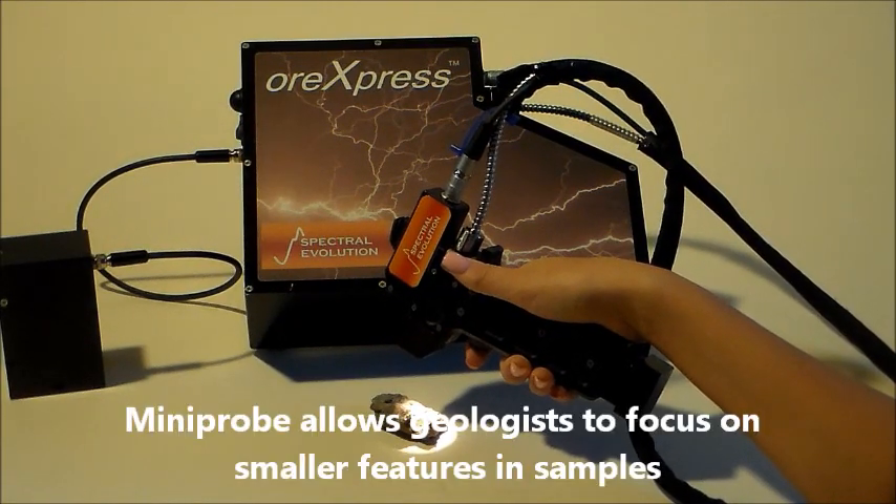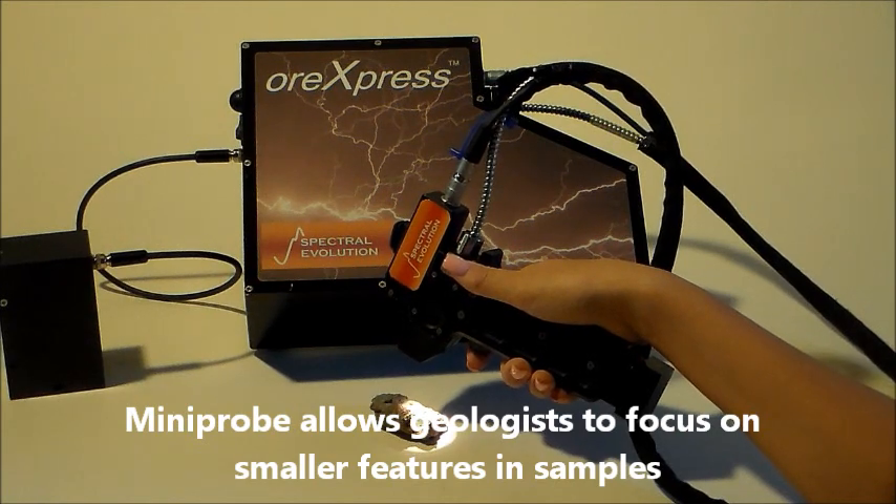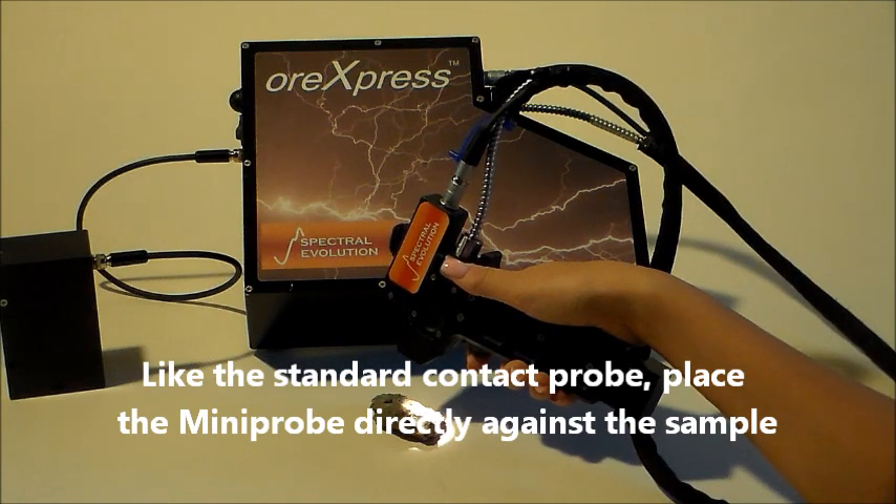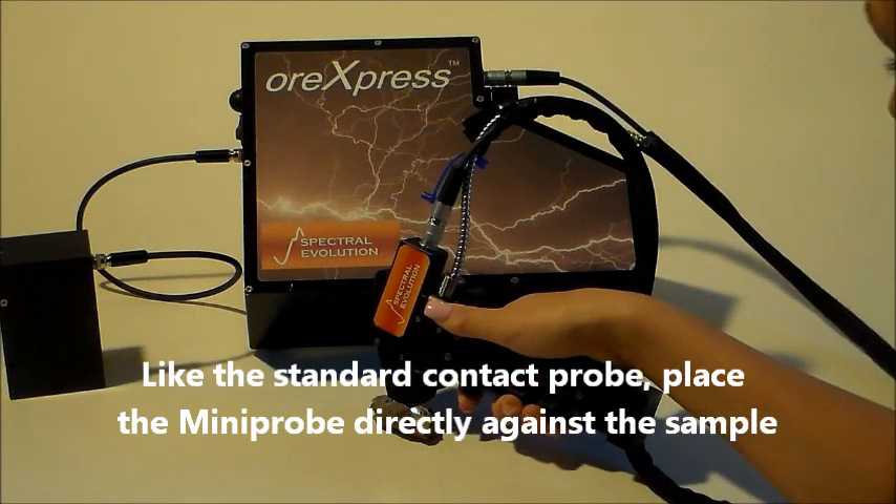Once a reference is taken, turn on the external trigger in Darwin. The mini probe allows a researcher to focus on smaller features in a sample. Place the mini probe directly in contact with your sample to scan.